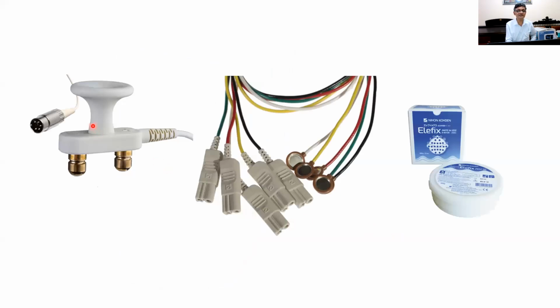And this is a stimulating electrode, the leftmost one. This one gets connected to the machine. And these are very small, less than 1 or 2 centimeters or so. They are connected to a wire, and the end of the wire connects to the machine, the junction box. When you ask the machine to stimulate, the machine will give an impulse and stimulate the nerve using these 2 electrodes. And then on the muscle, we connect the recording electrodes, and the other end of the recording electrode is connected to the machine, right?